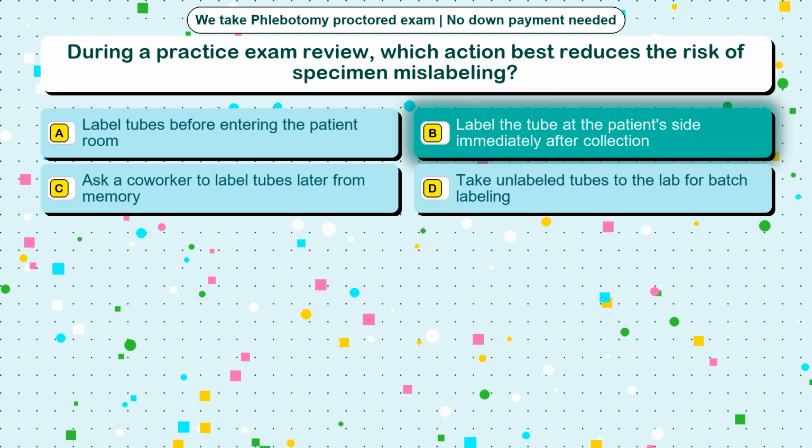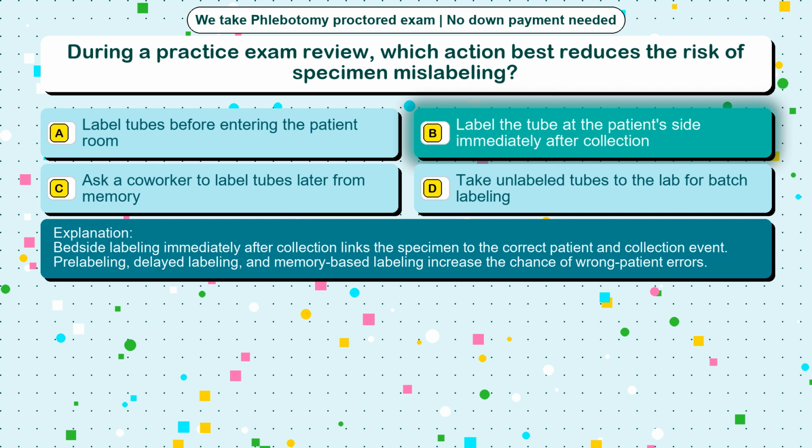The correct answer is option B. Label the tube at the patient's side immediately after collection. Bedside labeling immediately after collection links the specimen to the correct patient and collection event. Prelabeling, delayed labeling, and memory-based labeling increase the chance of wrong patient errors.